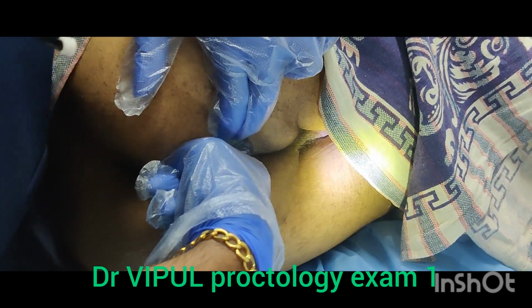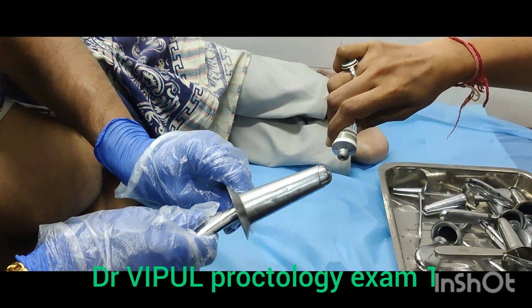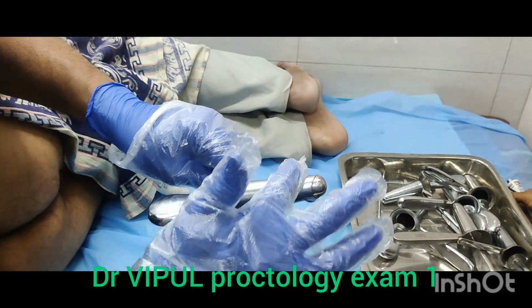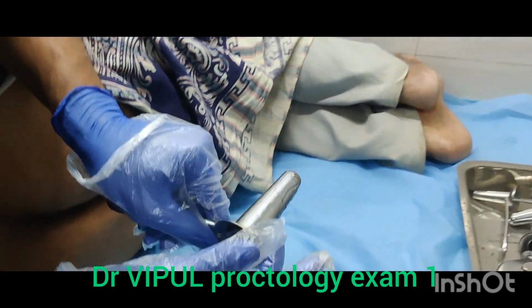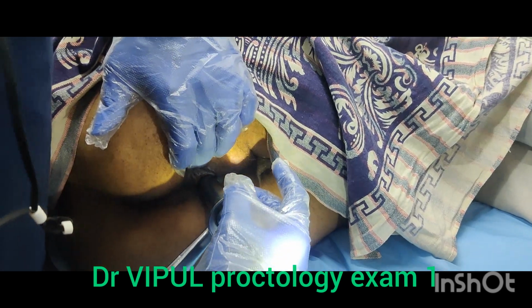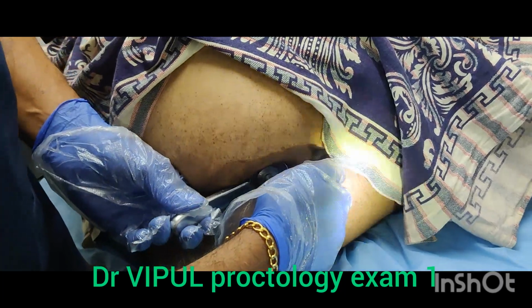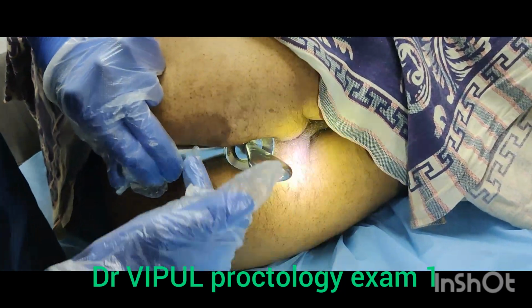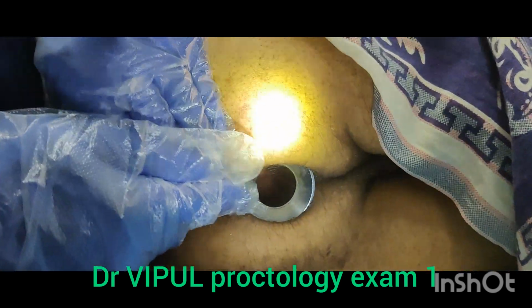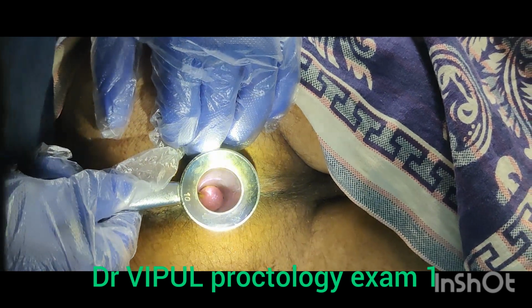Flexion of both the knees and both the hips is important for the examination as well as proctoscopy. I am using this multiple proctoscope from a single company, so there won't be a mismatch of female and male obturators. During insertion, the patient is asked to take a deep breath in and out to relax the sphincter, and the handle must be towards the sacral cleft only. We have to use only the battery light, not the mobile light.